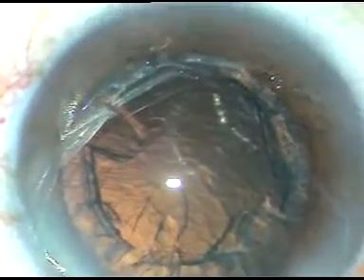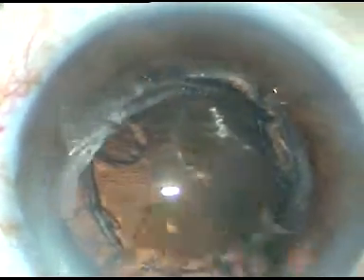I usually use a Simcoe cannula to remove the cortical lens matter. If you are comfortable, you can use anything else like coaxial I/A or bimanual I/A. The Simcoe cannula is actually a coaxial I/A. The cortical lens matter is being removed. Lots of cells stick to the posterior capsule and can be polished just by the irrigating fluid of the bimanual I/A. The cortex is removed.